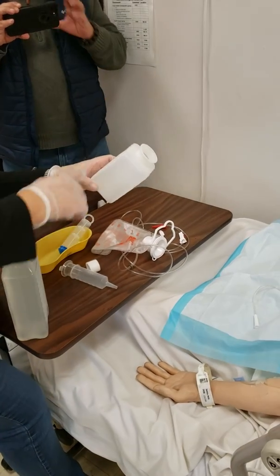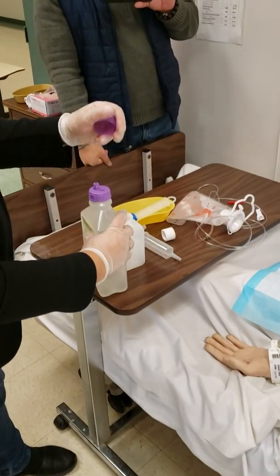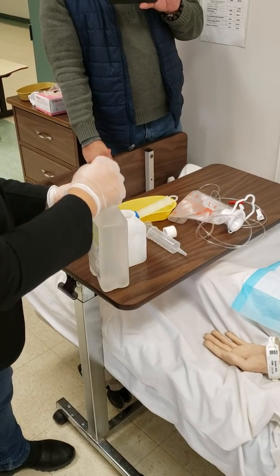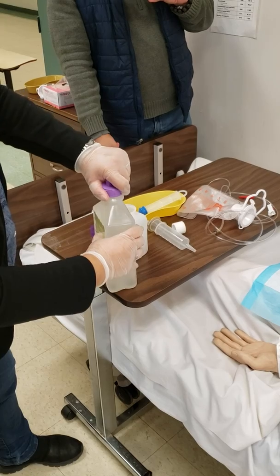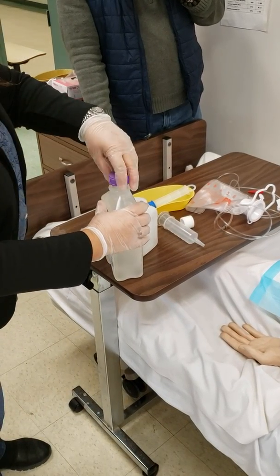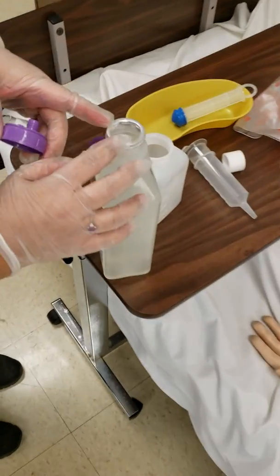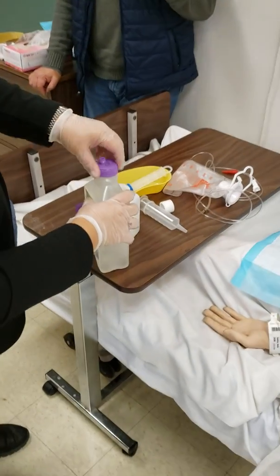You can measure from here, you pour it, but first you have to open this and wipe it with alcohol, and then pour it. Usually there's a foil inside, so there's a foil here. You have to rip it first and then put it back.